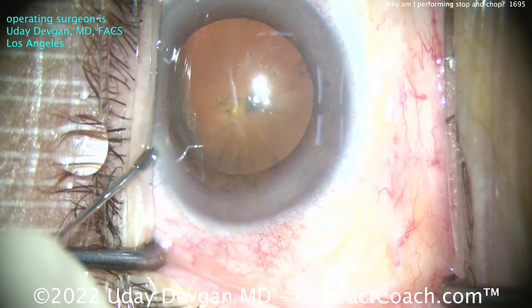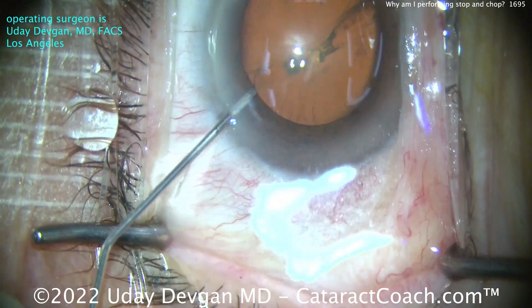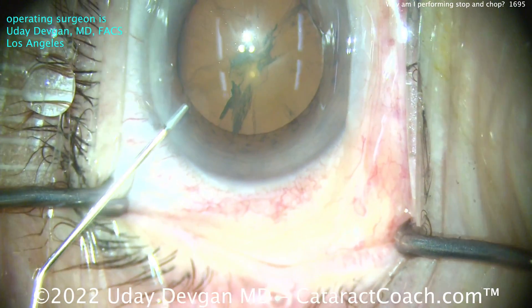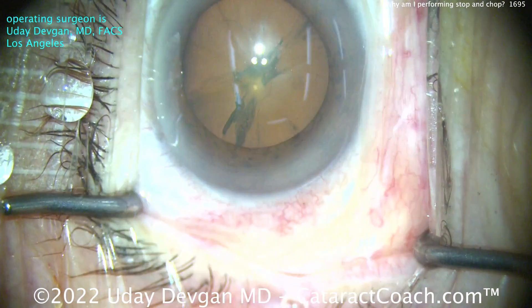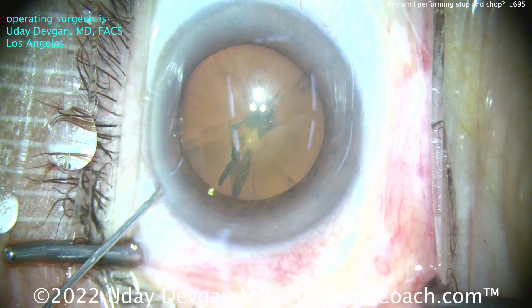Let's be frank here. You should know how to perform all techniques of nuclear phaco — all of them. I know all the techniques, I promise you. And there are a certain number of cases where stop and chop may be better than FACO chop.